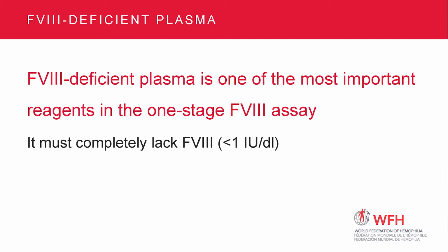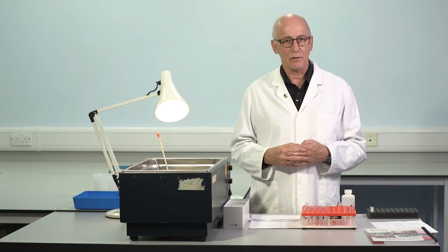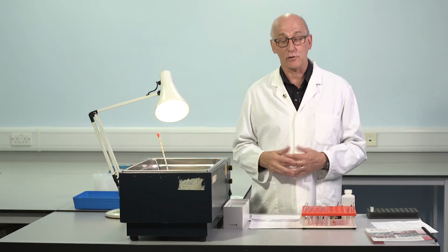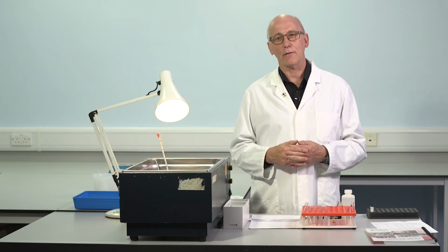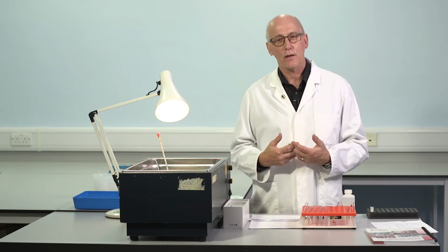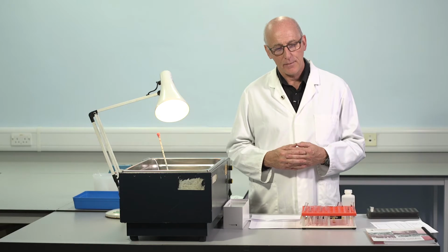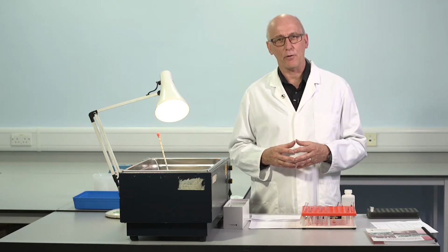On the other hand, we're in an era now where an increasing number of patients are on prophylaxis, and that's a fantastic thing, of course. It means that there may not be so many patients who are spending the time where their factor VIII level is below 1 international unit per decilitre, and again, that's a really good thing. We've also got ethical issues about using patient material, and of course there are also implications in relation to transfusion-linked viruses. So for many years now, the vast majority of factor VIII deficient plasmas have been prepared starting with pooled normal plasma, from which factor VIII is specifically removed. Can be done chemically, most often using antibodies, immunodepletion.